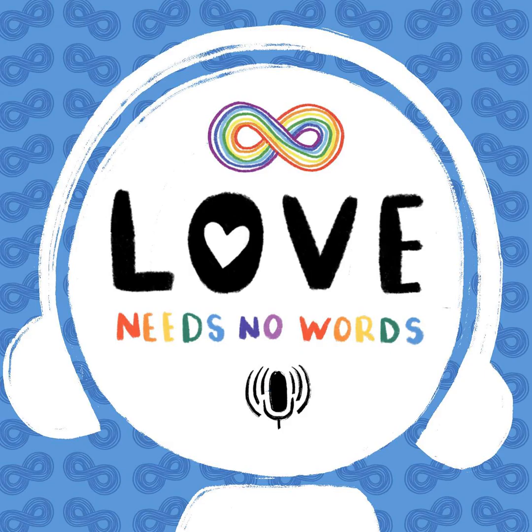If you choose a robust, high-tech AAC app, and that means an app that has thousands of words and all different parts of language, you can use it to communicate for all the different things you may need to. It's got single words, it's got phrases, you can record on it, it's got the keyboard. We always start with literacy straight away as well. We don't wait to do that; give them the keyboard. As long as it's got all those things, and it's got room to grow with the child, grammar included, then that's a good decision. You can then move on with the most important bit, which is learning how to use this yourself as a parent, so that your child learns the power of what it can do for them.